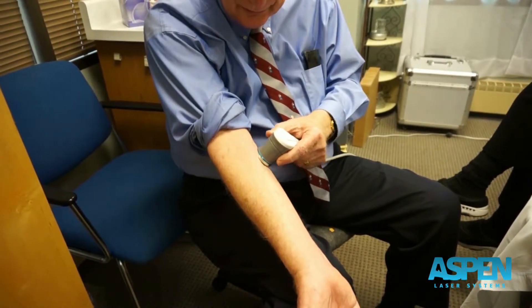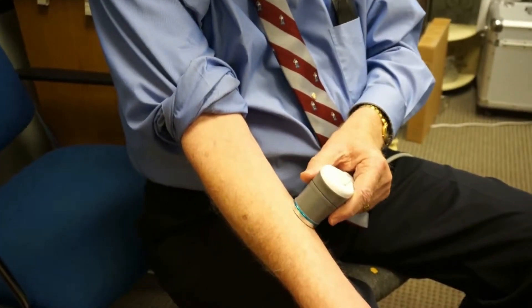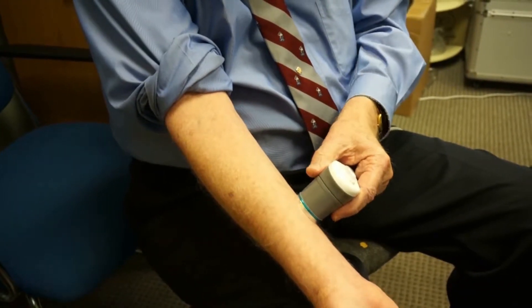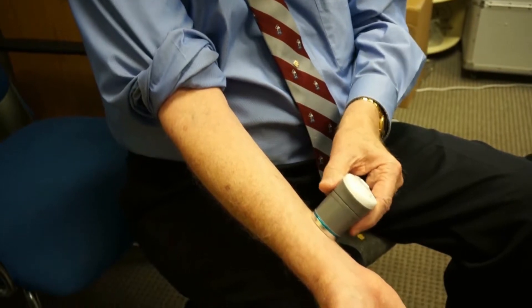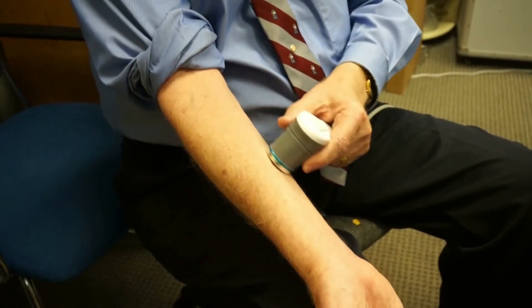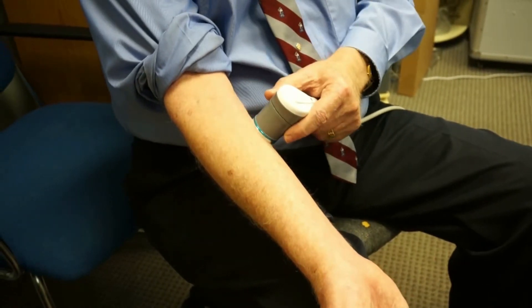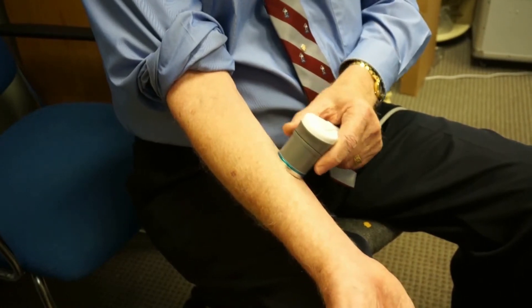I like to use a circular pattern — I was taught this in physical therapy class. I kind of loop back over the prior area, catching about a third to half of it as I go. That seems to work better. I don't particularly like going both ways like that, as some manuals show. This circular method seems a bit nicer; patients like it better.